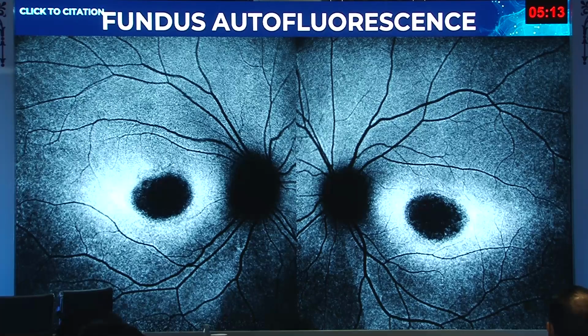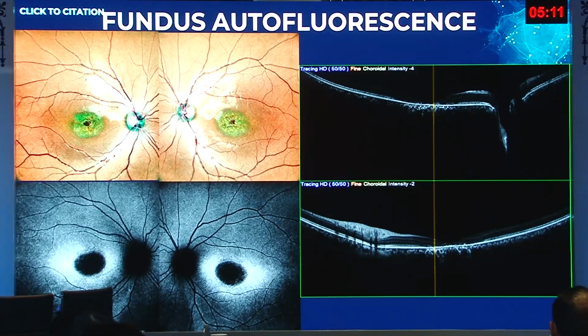Extremely important in cases of dystrophies, and patients with CSR. So it's a patient with a cone dystrophy. When you have cone dystrophy, always for publication purposes as well as to follow up the patient, you need to have this fundus autofluorescence image where you can see a bullseye maculopathy. And then you look at the OCT also, you can see the photoreceptor atrophy.